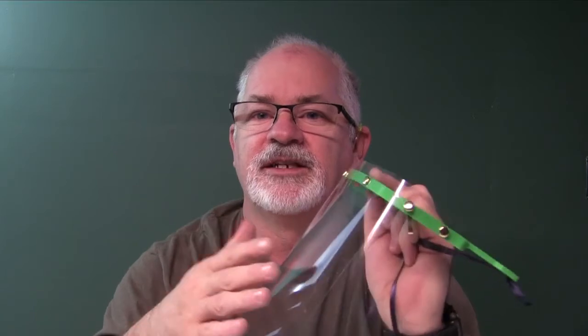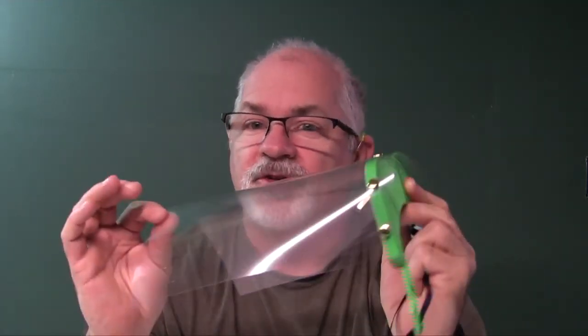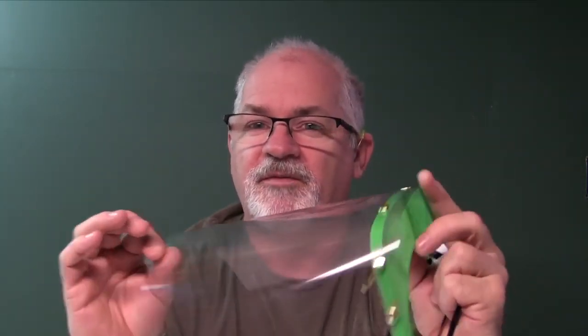Now this thing, depending on the quality of plastic, we can wash these, we can disinfect these. They can be replaced, and this part you can reuse over and over. So this is what we've been producing, and I hope this video has been helpful on both putting our 3D printed pieces together and how we actually attach the face shield.